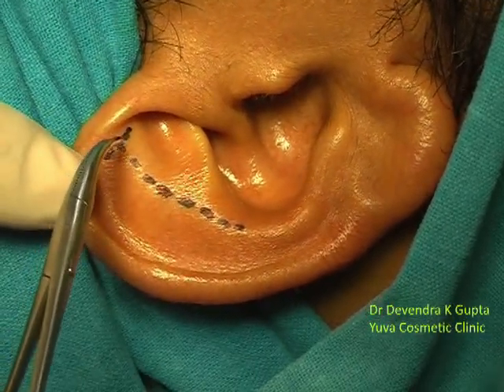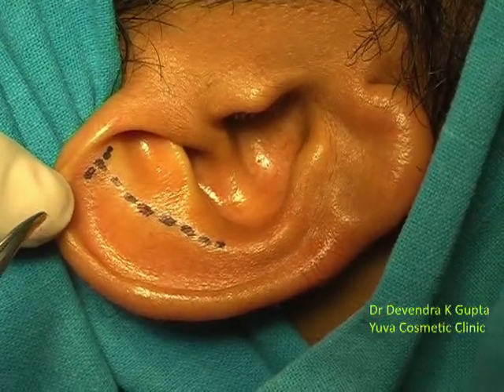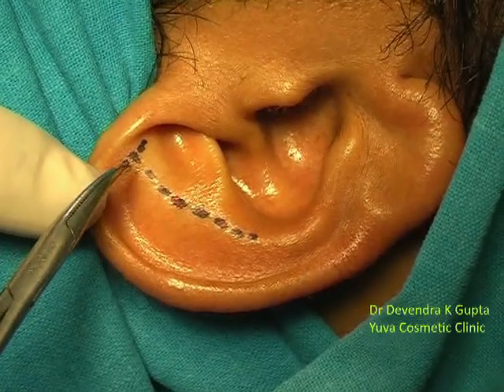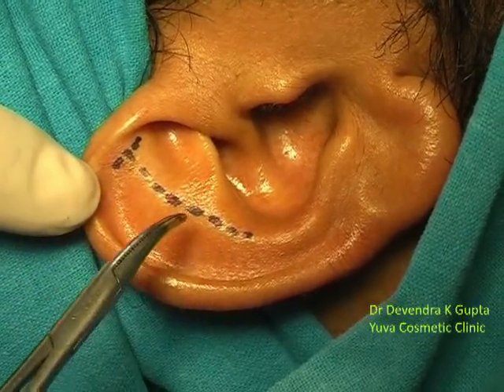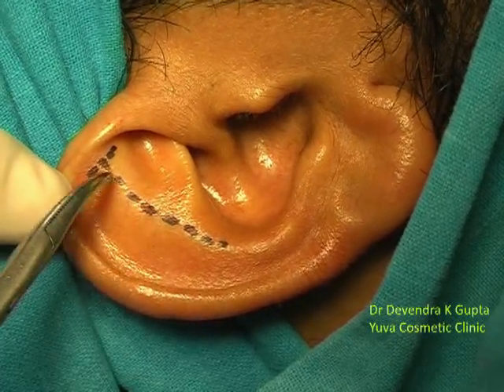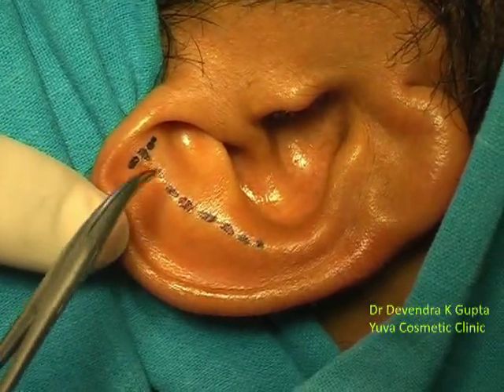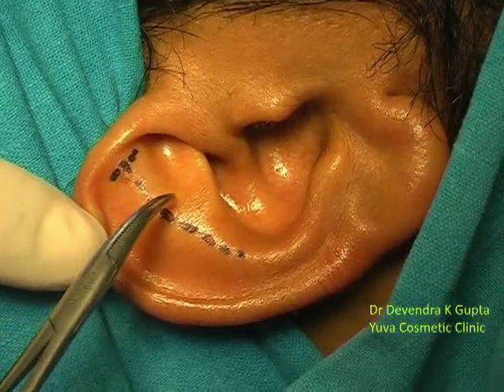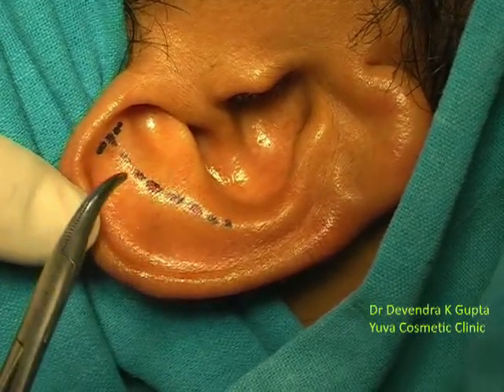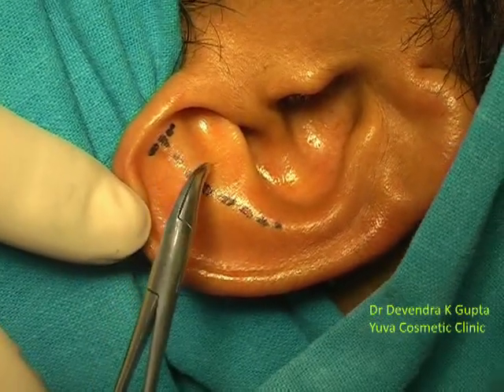I will make a small incision, as marked here, under local infiltration anesthesia, and we will undermine the tunnel as marked, just at the level of the pinna cartilage. After this I would like to abrade the cartilage at the anti-helix border to weaken it on the anterior aspect, and then approximate or stitch the two parts of the anti-helix border to enhance its curvature by making small puncture hole stitches — two stitches here and one stitch here.